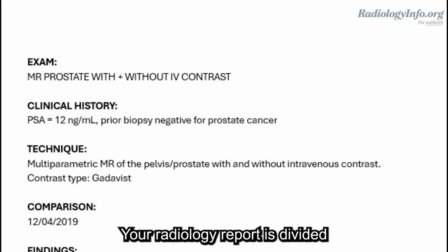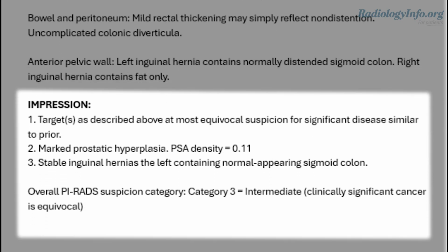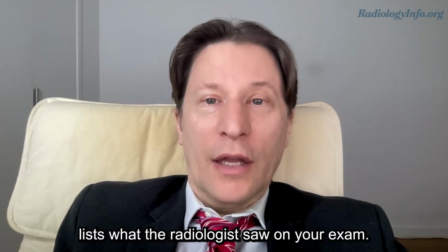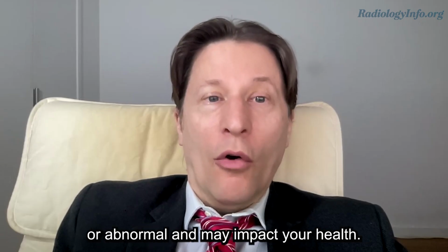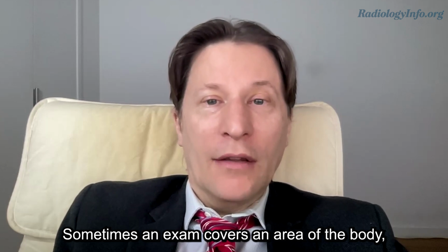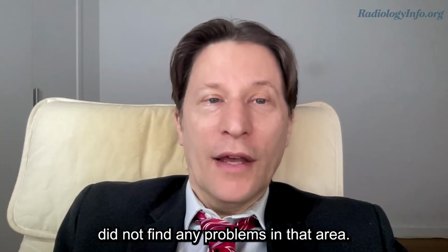Your radiology report is divided into different sections: clinical history, technique, comparison, findings, and impression. Each section contains different information. The findings section lists what the radiologist saw on your exam. Findings may be normal, abnormal but not likely to cause problems, or abnormal and may impact your health. Again, some abnormal findings may not significantly impact your health. Sometimes an exam covers an area of the body, but the report does not list any findings. This usually means the radiologist did not find any problems in that area.